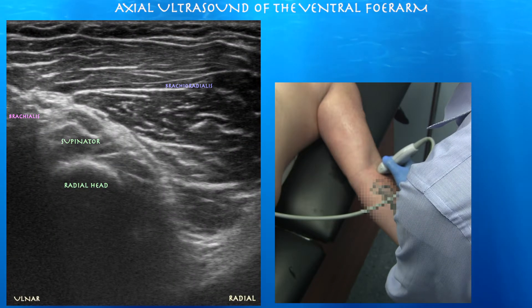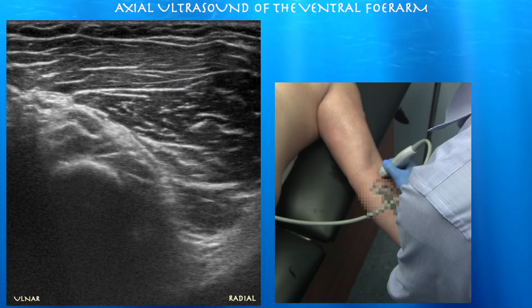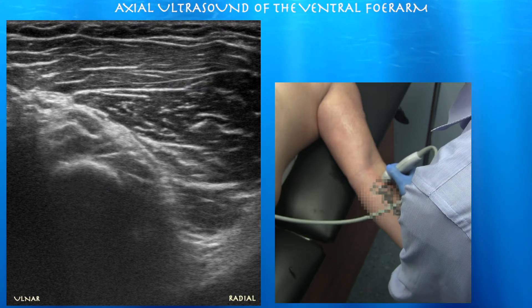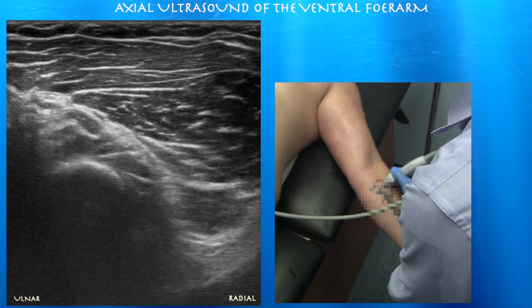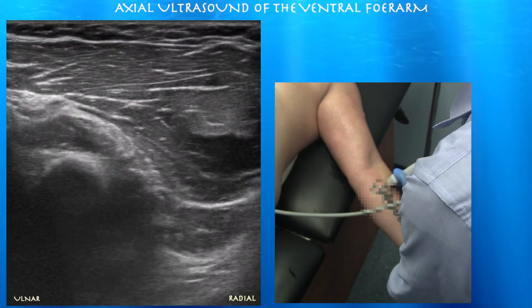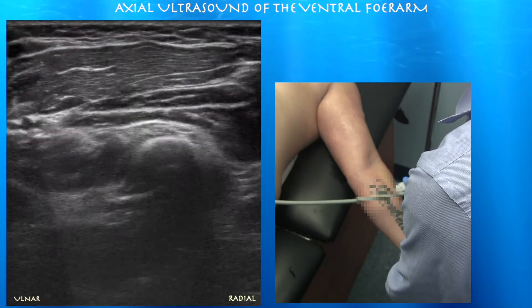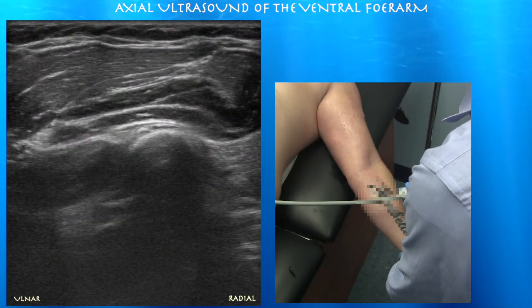Radial head. Here we're going a little bit distally and you can see the supinator muscle overlying the radial head. You can see the brachioradialis muscle above it, and again that big muscle overlying the radius is your brachioradialis muscle.